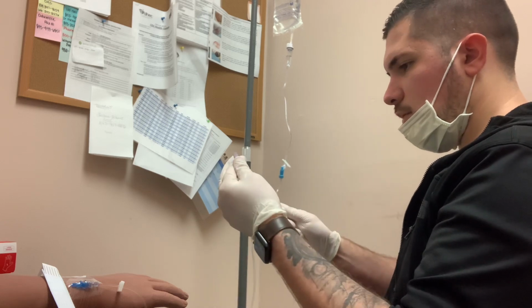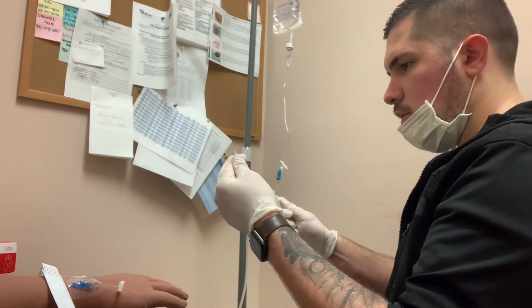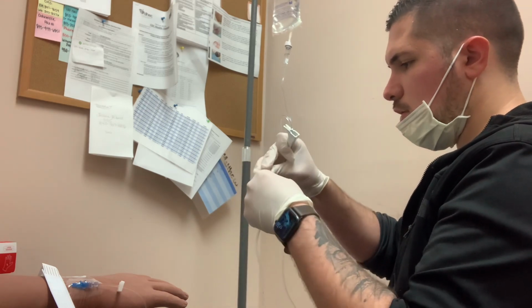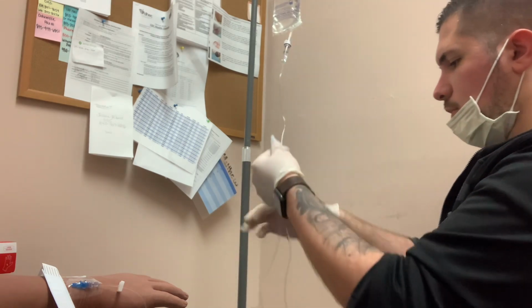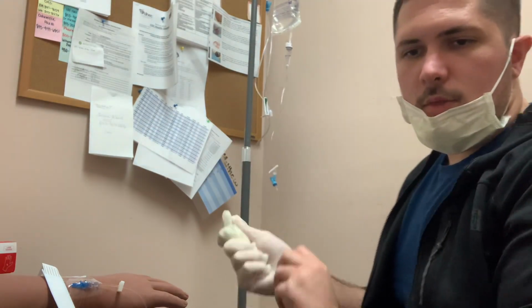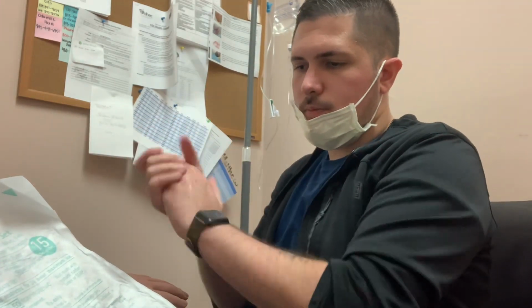And twist that without touching. And we'll clamp that. So now our IV tubing is primed. We'll take this off, do hand hygiene.